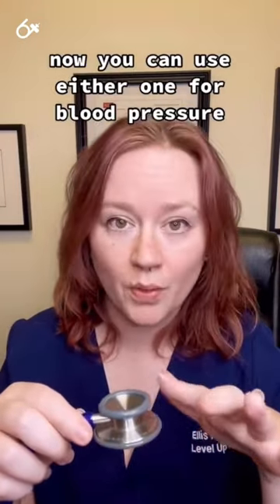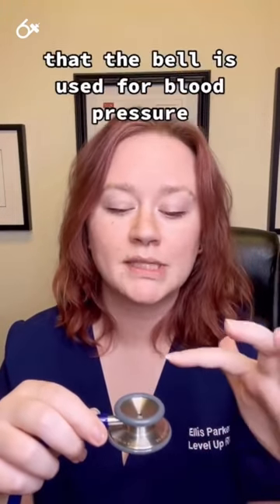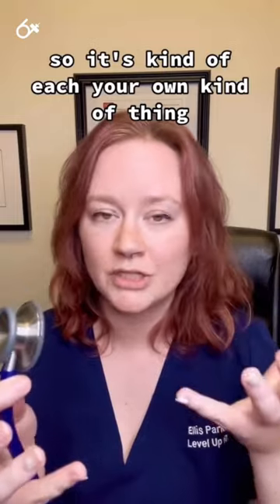Now you can use either one for blood pressure. It is sometimes recommended, especially for newer learners, that the bell is used for blood pressure. I personally like to use the diaphragm, so it's kind of each your own kind of thing.